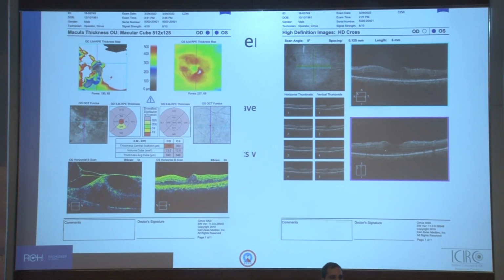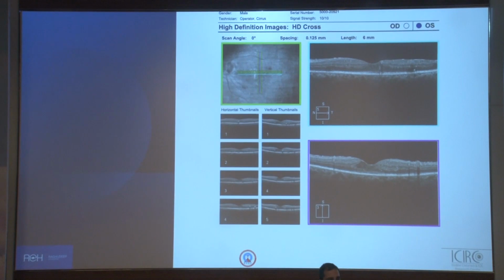Here is a one-eyed gentleman. His right eye is almost a burnt-out retinopathy with a lot of tractional component, and he hardly has any vision in the right eye. The left eye presents with diabetic macular edema and a cataract. We went ahead with the dexamethasone implant and the cataract surgery, and we were very happy to see that he regained his normal visual acuity, and the foveal contour was beautifully restored.